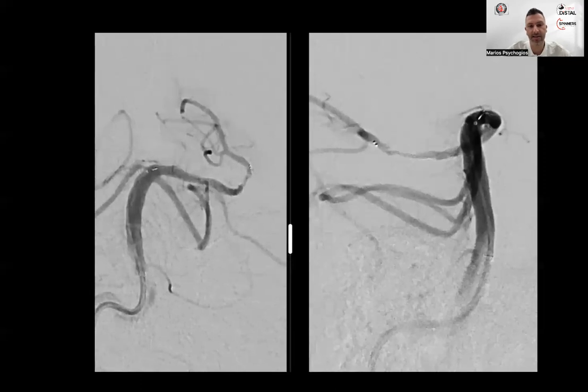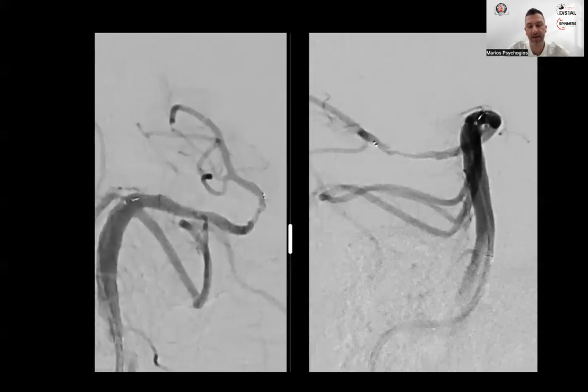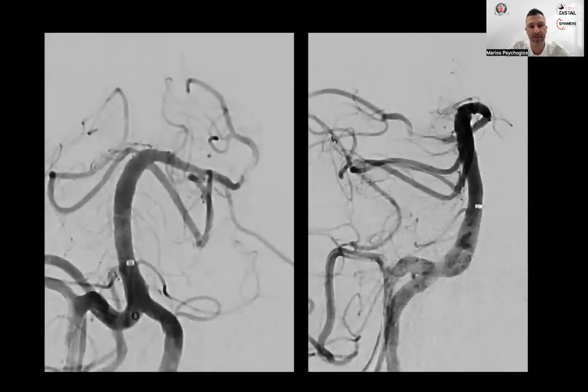And you can nicely see, I think, where the main clot or plaque was. And then you go on and retrieve this. And this is the result. So actually, for me, at this point, I was pretty sure it's ICAD related. But the question then is, okay, can you leave it like that and it stays like that? Or do you have to do something else?